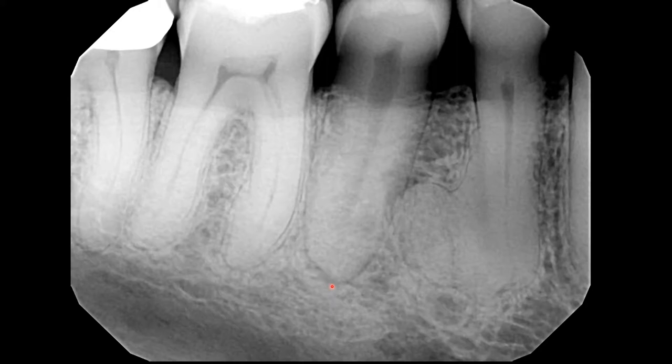The radiograph has recorded both the premolars, the first molar, and the mesial root of the second molar. We will focus primarily on the first premolar.